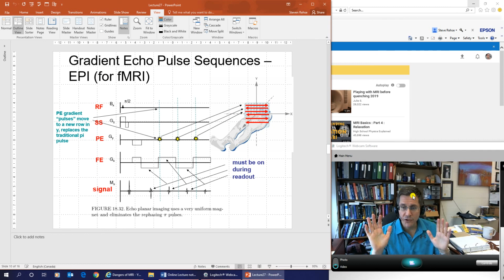Let me tell you just quickly, why are we talking about this? Because as I said, you have to do many, many, many of these measurements. You're waiting at time TR, even in the simple case we showed, 8 different rows. If you're waiting at least 1 time TR between each row, you're doing 8 of them. If you're waiting 3 TR, for example, so that's like 3, 4, 5 seconds times 8, maybe you got 30, 40 seconds for the whole slice. How are you going to measure brain activity if it takes you 30 seconds? It's not possible. If you're trying to measure your brain lighting up because you're thinking about something or doing something, we need a measurement in milliseconds. This is way too slow.